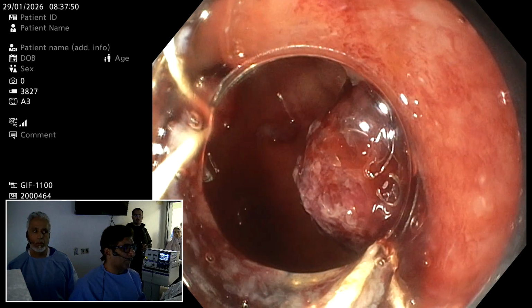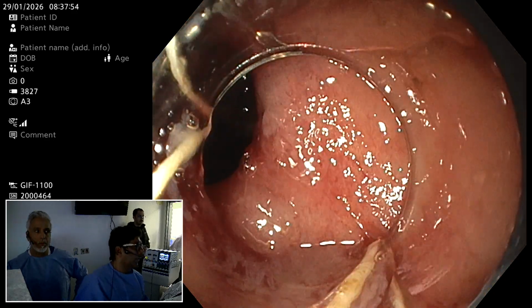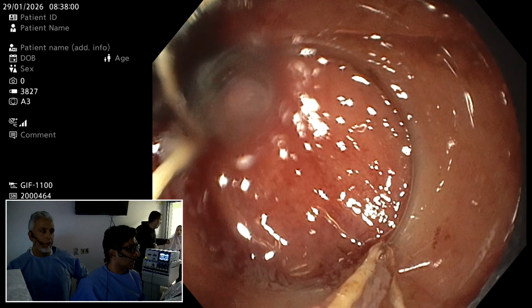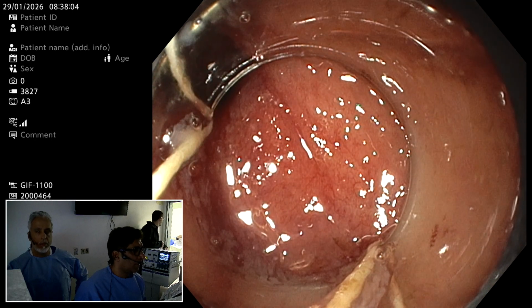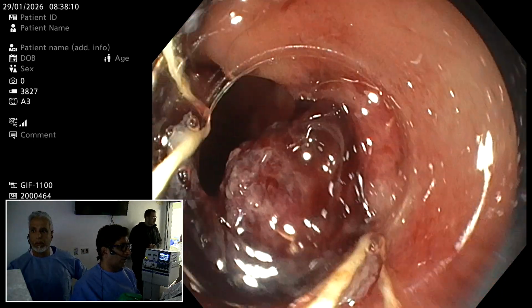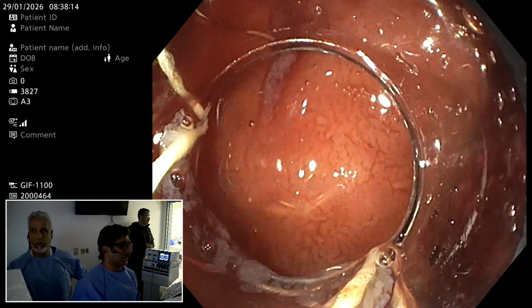Can you, yeah, please go ahead. I'm not able to hear you, unfortunately. Can you be a bit louder, please? Or somebody can relay the. We can, but as I said, once we have a proper biopsy available for the lesion, otherwise we are increasing the chance of perforation.